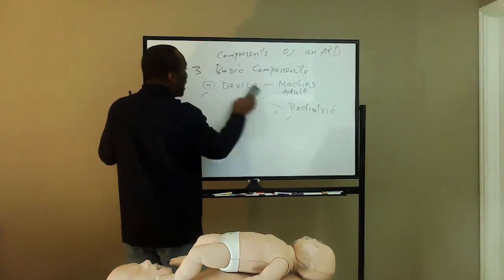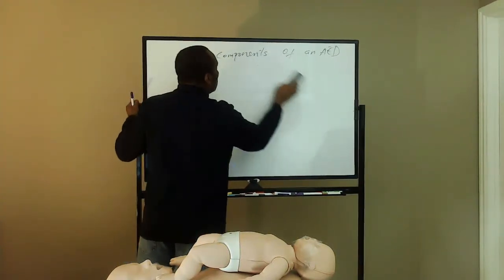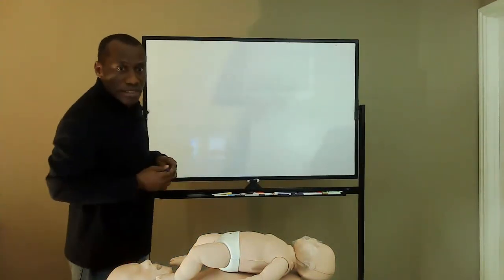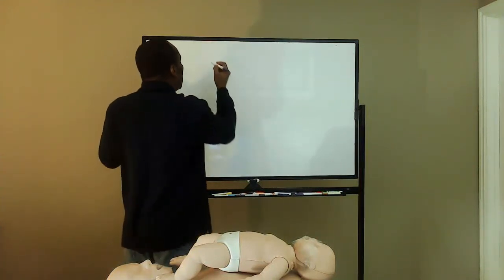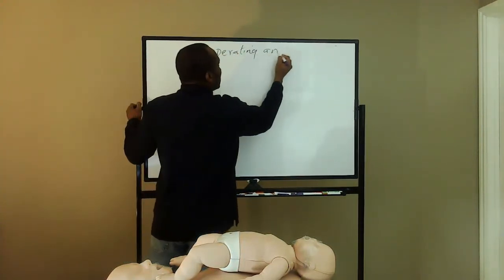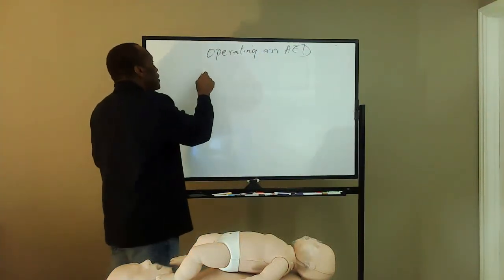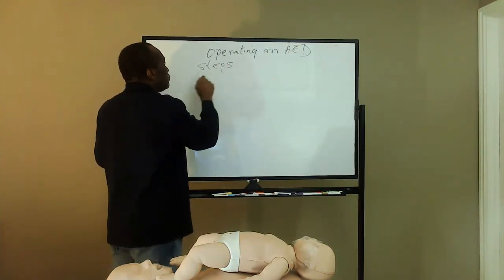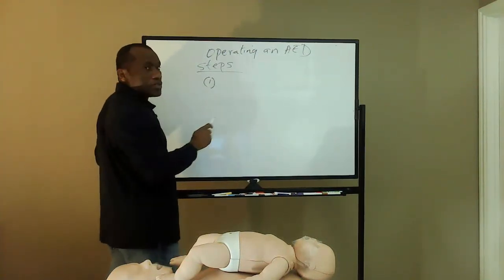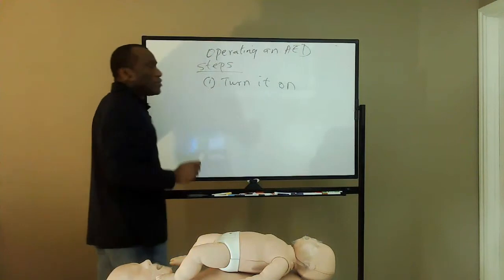Let me talk about how to use this machine. How do you operate an AED? Very easy. An AED is very easy to operate. So there are basic steps here. The very first step is to turn it on.